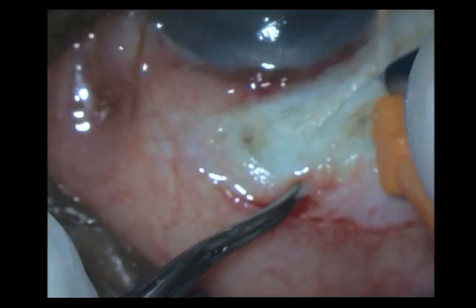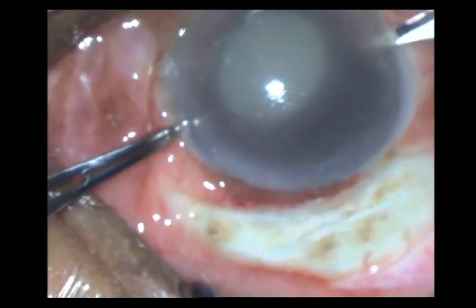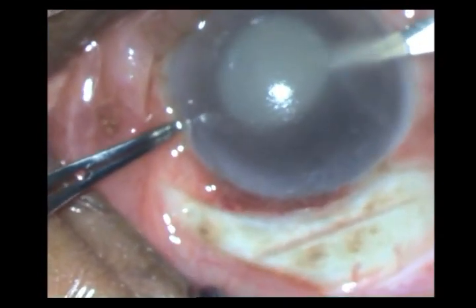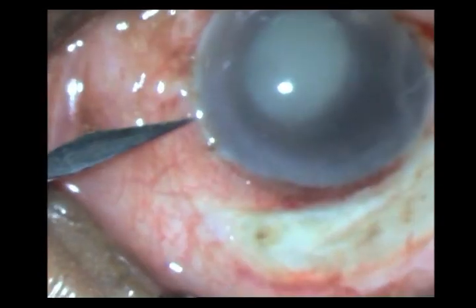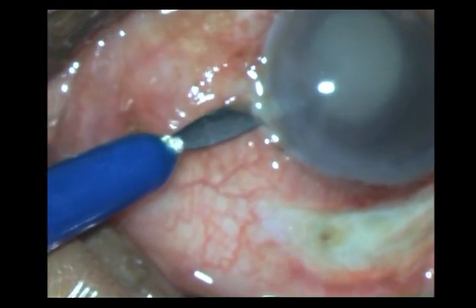Now that the scleral pocket is also done, I am entering with my side-port knife. Can you see those membranes peeling off from the periphery of the anterior chamber? I do another side-port on the other side just in case I need it, and there you can see another membrane just peeling off.